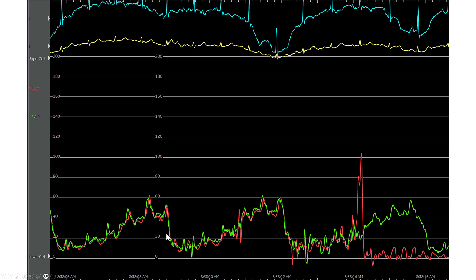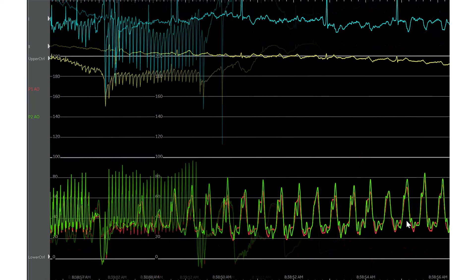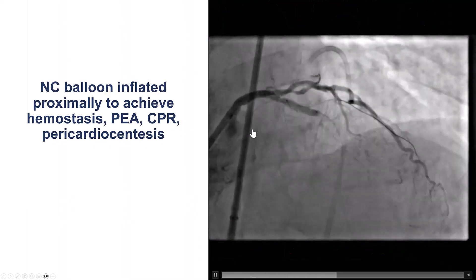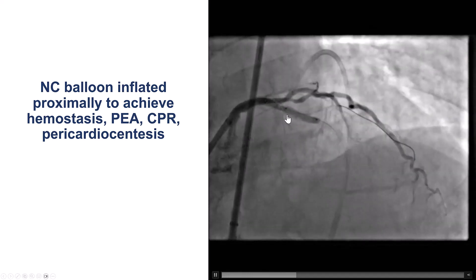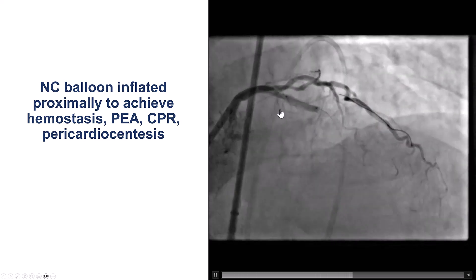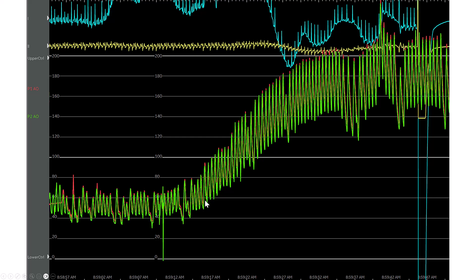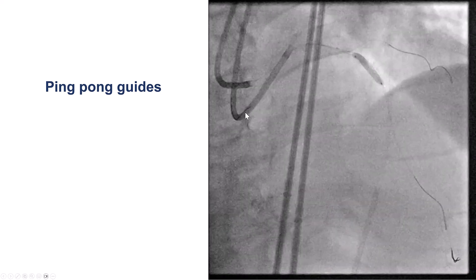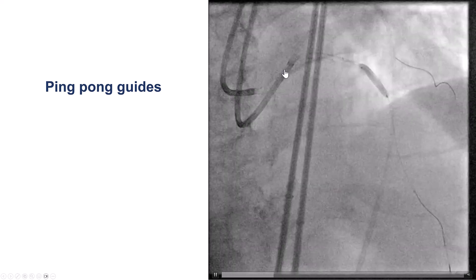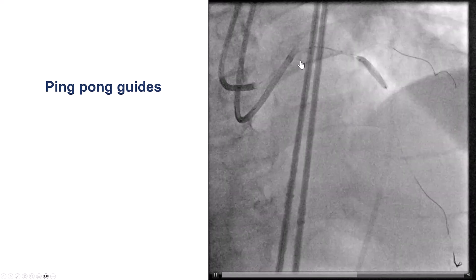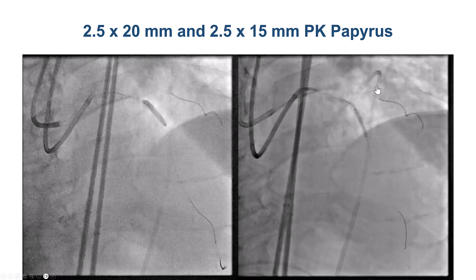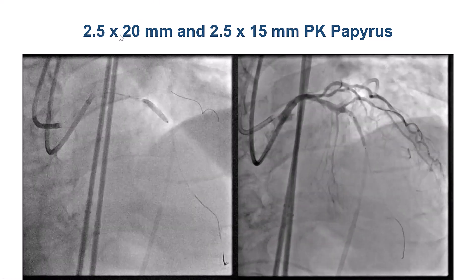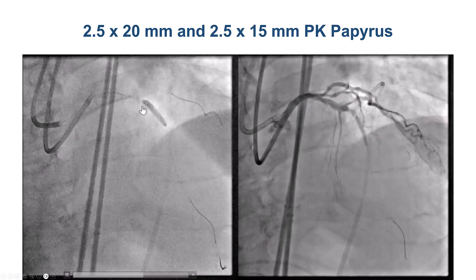At this point, we put a balloon up. The patient had significant hypotension requiring CPR. We were then able to do pericardiocentesis; the CPR was very brief. We now have occlusion of flow into the LAD. We decided this was a large perforation, gave some epinephrine with the blood pressure increasing significantly. Given the size of the perforation, we used the ping-pong guide catheter technique — a second guide catheter, transiently deflated the balloon, got a second wire through, and with some difficulty delivered a 2.5 by 20 mm and 2.5 by 15 mm PK Papyrus stent.